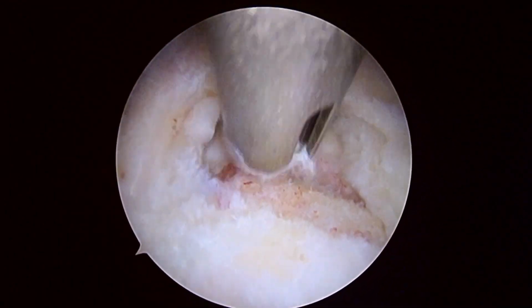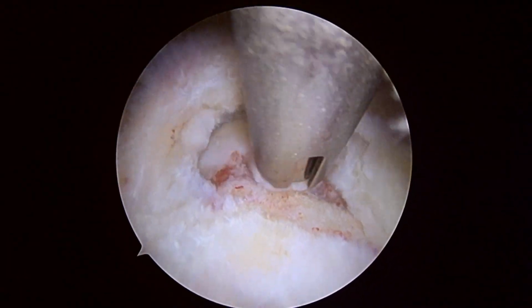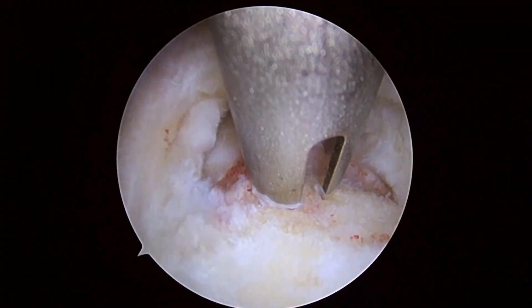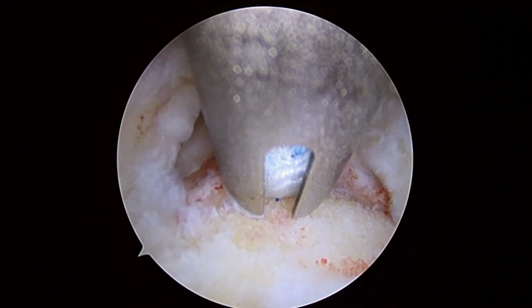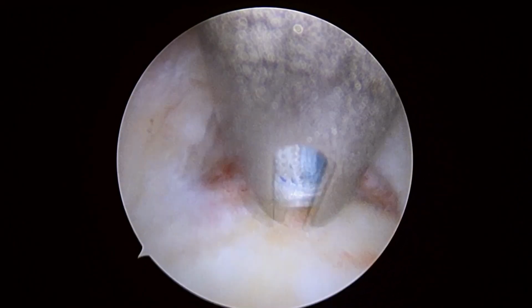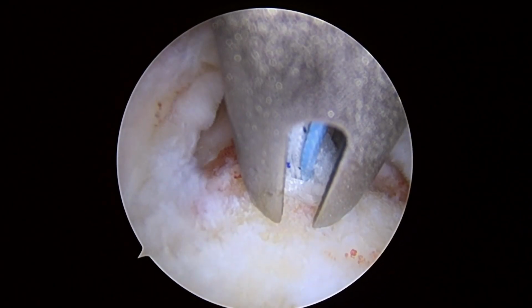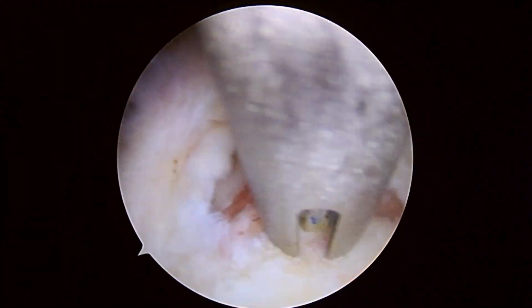We're going to place this about 5 or 6 millimeters back from the articular margin, which is where that white smooth cartilage stops. And we're going to place our anchor down right about here. So if you look carefully through that hole, you'll see the anchor is in there. We'll go ahead and slowly tap it down. Now it's down, so we'll go ahead and pull it out.